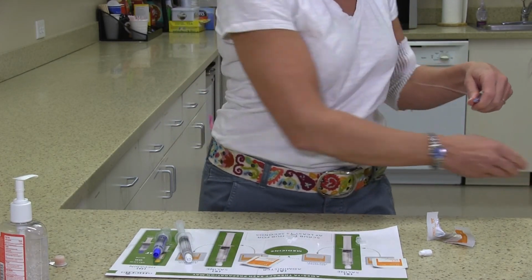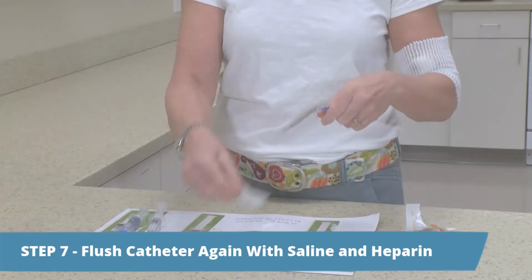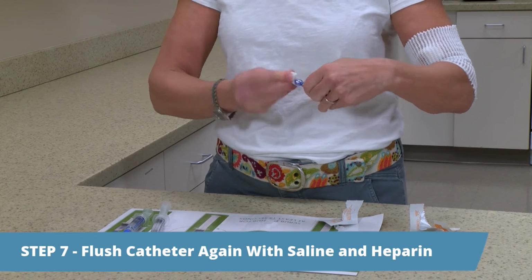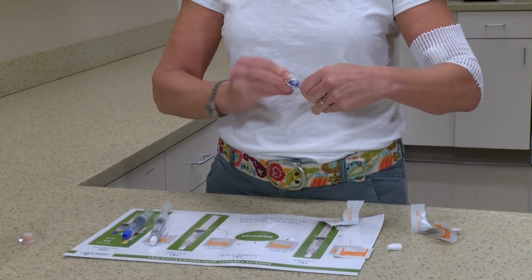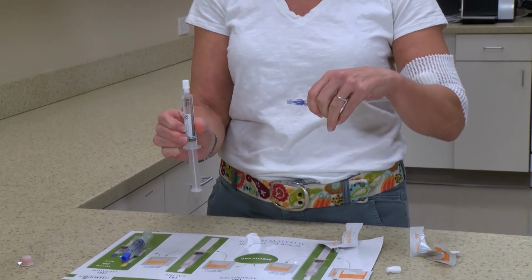Step 7, flush catheter again with saline and heparin. You will now flush your catheter with the next saline syringe, being sure to clean the injection cap again with an antiseptic wipe for 15 seconds. Throw the syringe away when the syringe is empty.